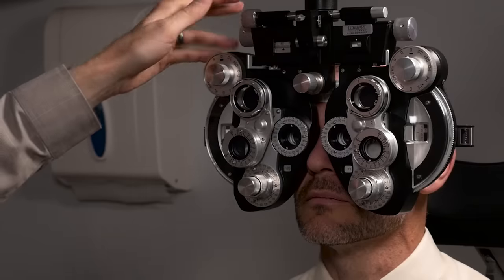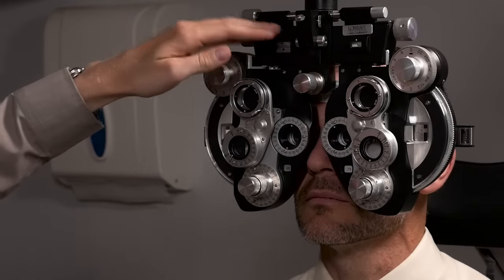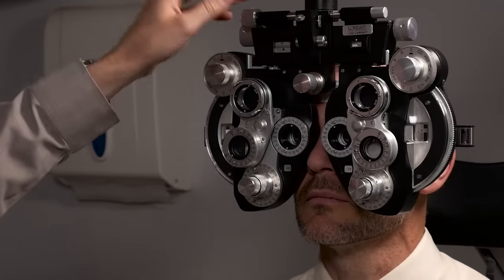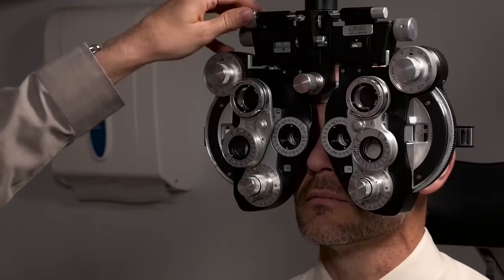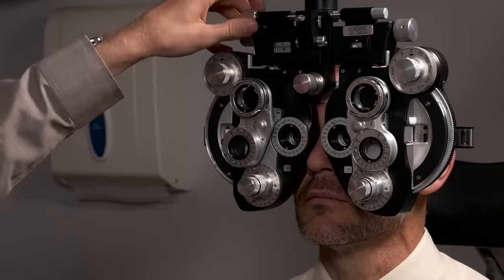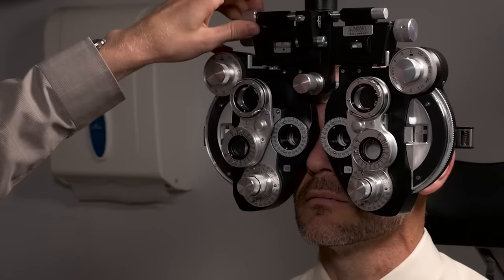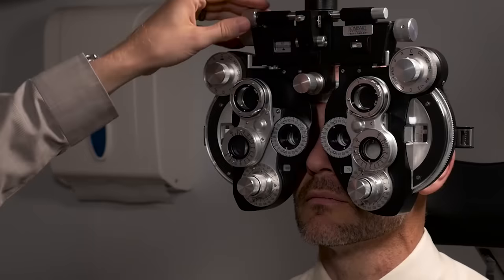Another important thing to factor in is to make sure that the phoropter is level. To do so you use this leveling window here and to adjust it you turn this dial above and you try to get it so it's just level right there so the bubble and the dot match up.